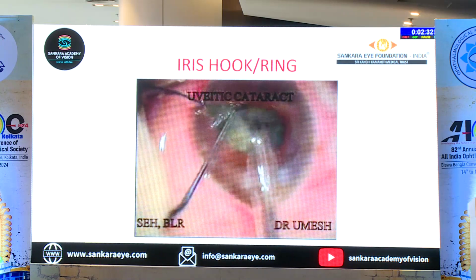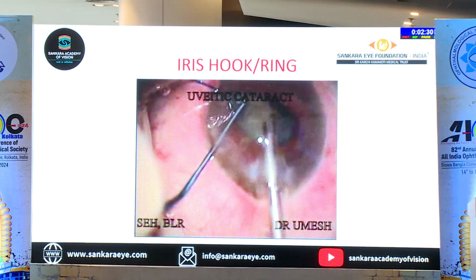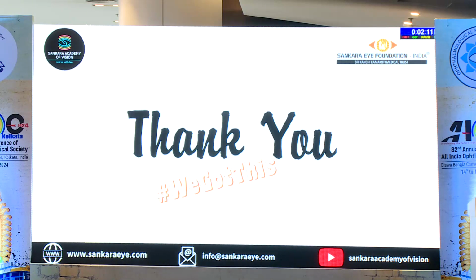The basic idea is respect the central safe zone and ensure all your fluidics and other parameters are within the central safe zone. By this, you should be able to ensure that even if you have a bad touch, one is obviously prevention. The other is if you have plan A, plan B, plan C, which is going to help you out.